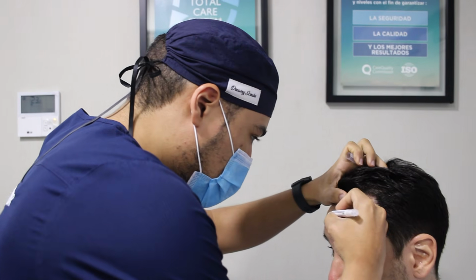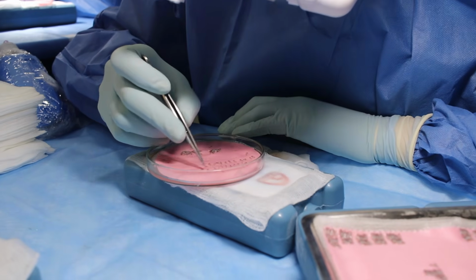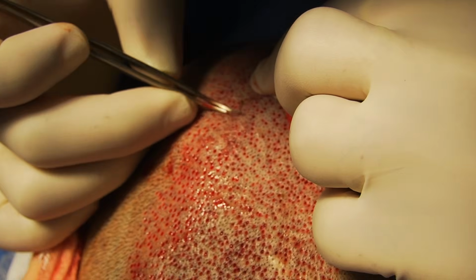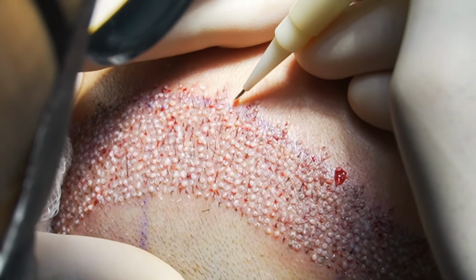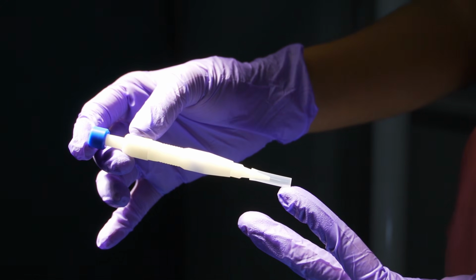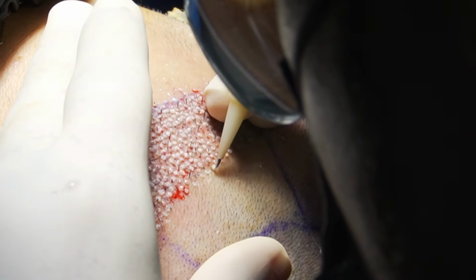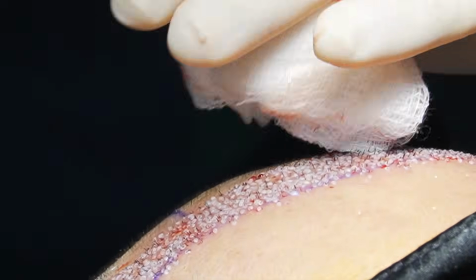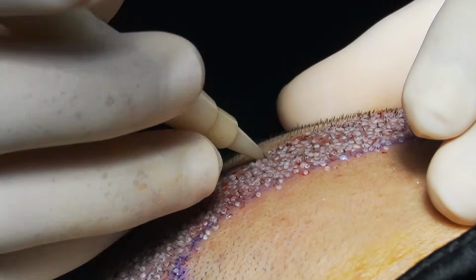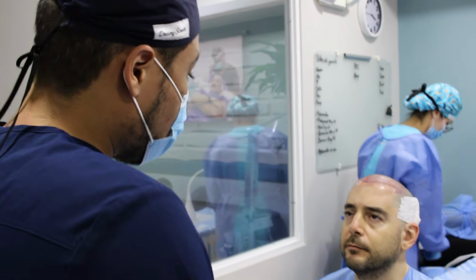Today, we want to show you, step by step, how a hair transplant using the DHI technique is performed at our DHI Panama clinic. The DHI technique, direct hair implantation, is characterized by a precise protocol involving the individual extraction and implantation of hair follicles. One of its key components is the exclusive DHI Implanter, an instrument designed to allow the physician to precisely control three essential aspects during implantation: the direction, angle, and depth of each follicle. This level of control makes it possible to recreate the hair's natural growth pattern and perform a minimally invasive implantation while also promoting a faster recovery.